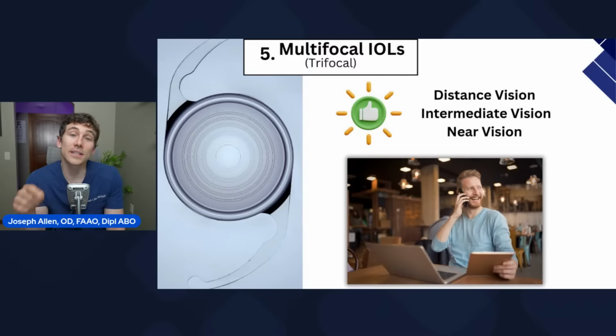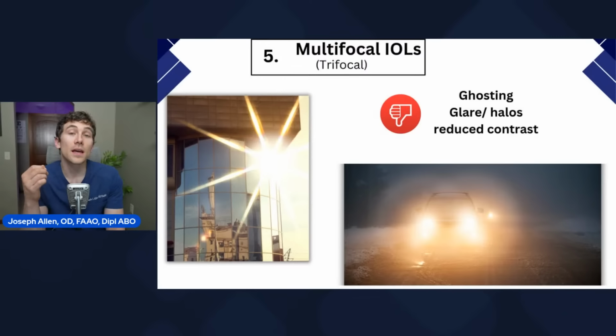The downside, just like the extended depth of field lenses, is a lot of people can suffer from ghosting, glare and halos, and reduced contrast in your vision. So that means that at nighttime or in dim light, you may have more challenges seeing clearly. And if you're driving at nighttime, you're going to see a lot more glare and a lot more halos from headlights.